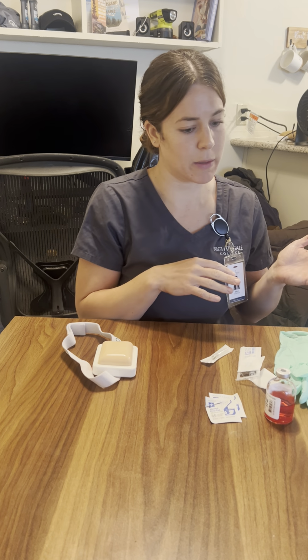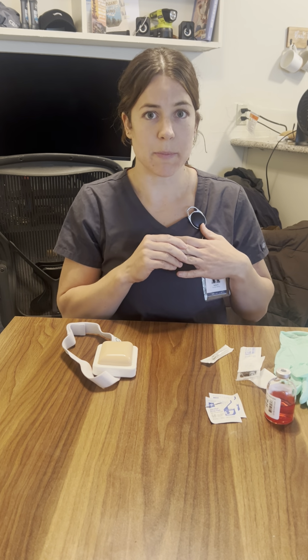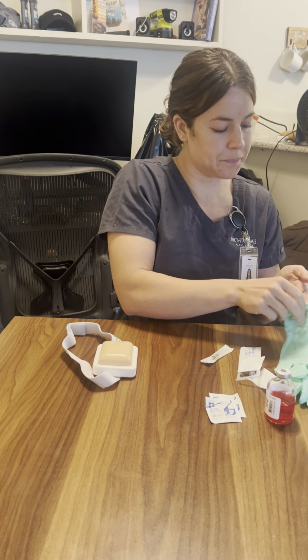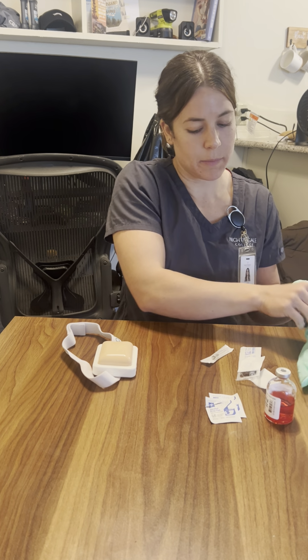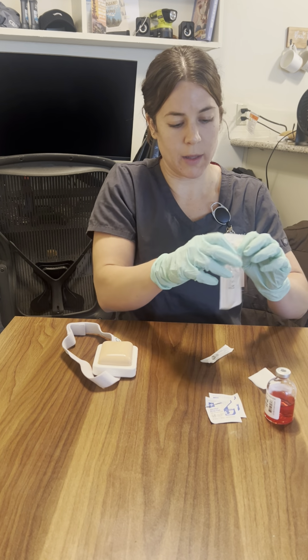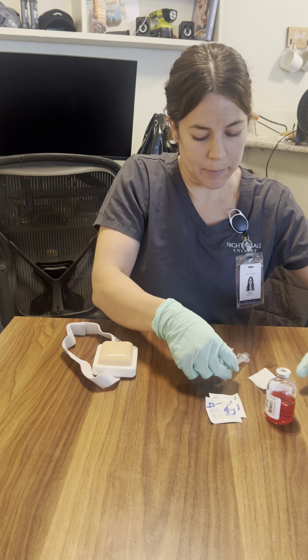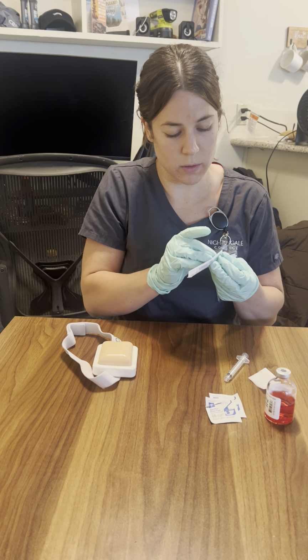So I'm going to go ahead and double check that I have the correct medication, the correct dosage, and then also go over my supplies. But first I'm going to do some hand hygiene and put some gloves on. So for this injection, we are going to be using a 3 milliliter syringe. So I have my 3 milliliter syringe right here. And then I'm going to use a 1-inch 22 gauge needle.